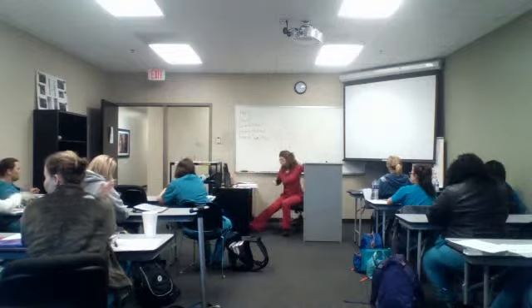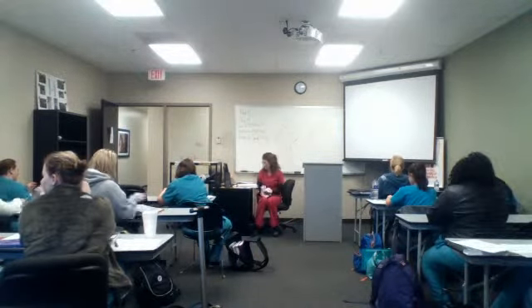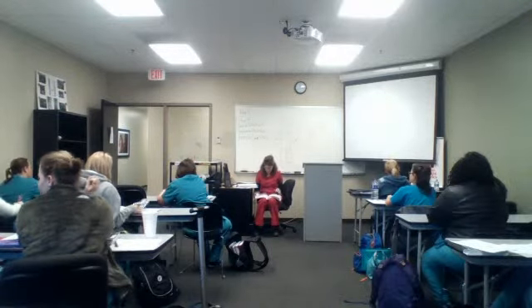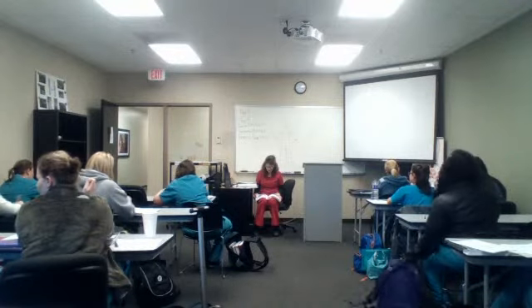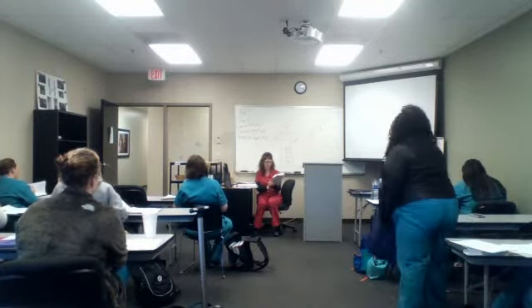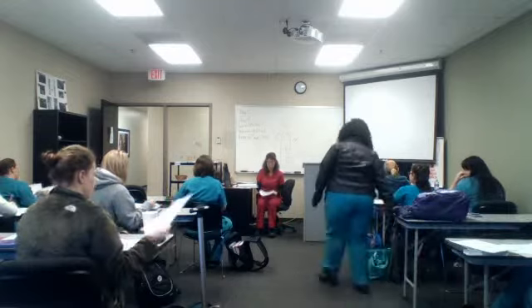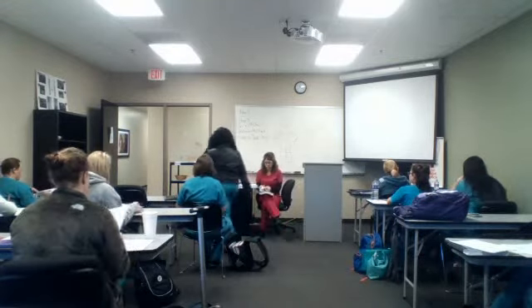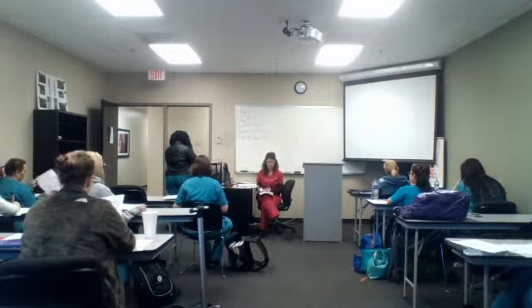Alright, what do you want to look at? Number one is to list some reasons why you do a vertebral exam. It could be because of any of the vertebrobasilar symptoms, or that the vertebral is what type of flow? Retrograde. Or it could be any of those flows that we learned about, tardus parvus, all those things, okay?